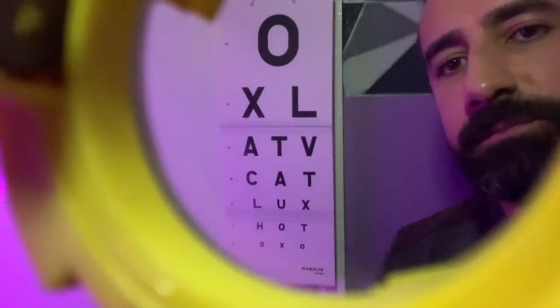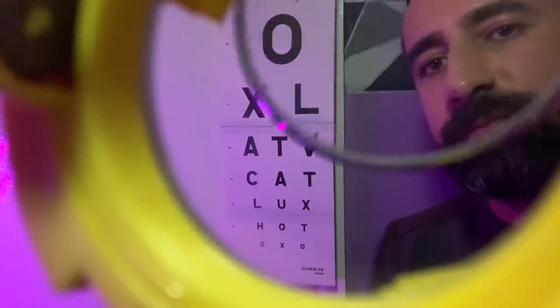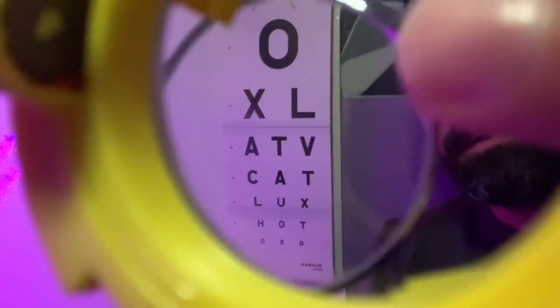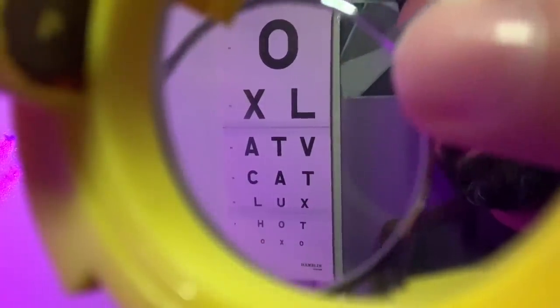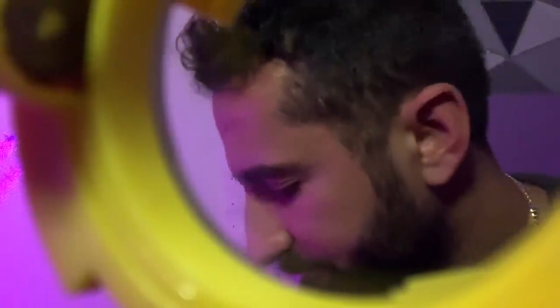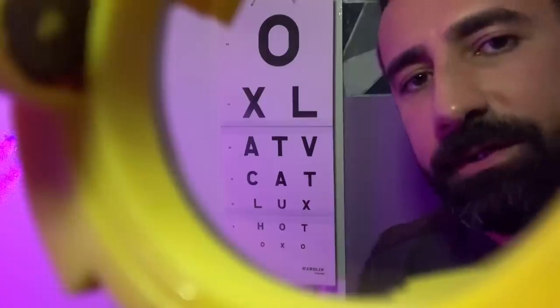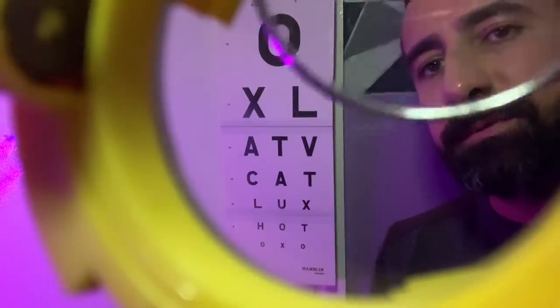Okay, let's show you this minus 0.50 diopter sphere. Is the smallest row sharper with the lens? Without. Better with, or without? With? Without. Slightly without. Excellent. Let's just drop that down and go for a minus 0.25 diopter sphere.